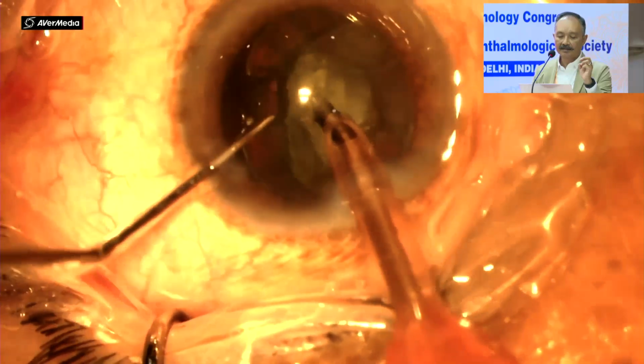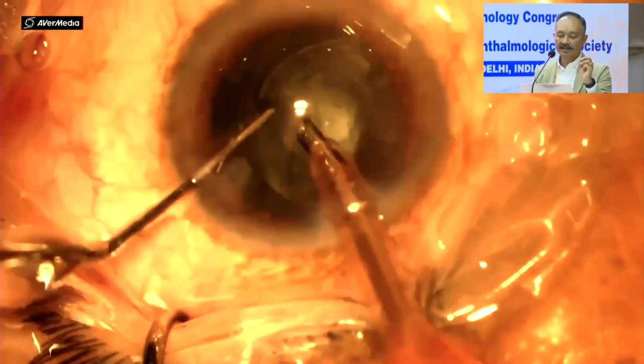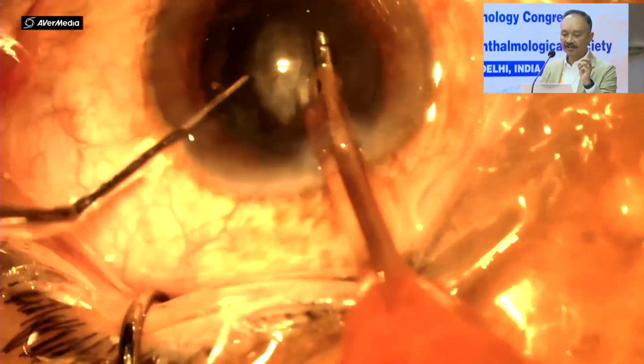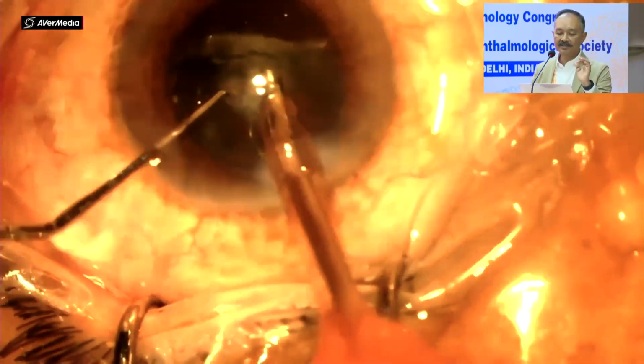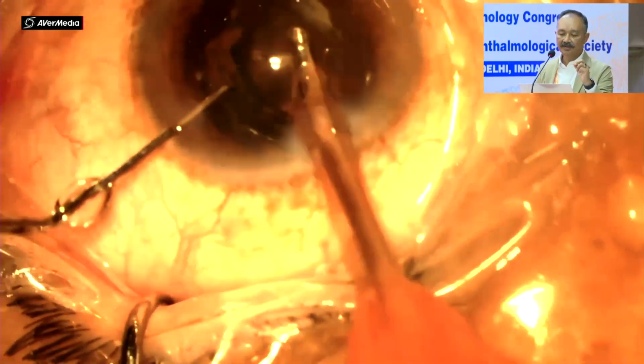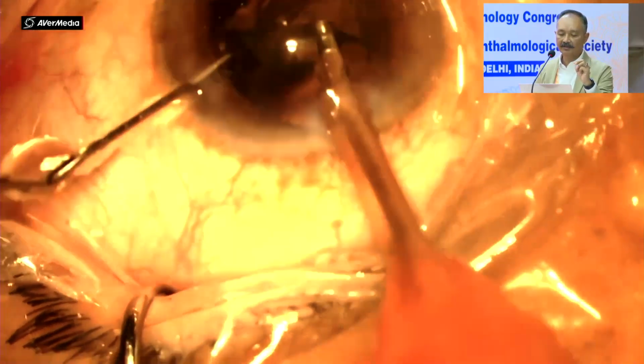and the central hard nuclear part has been removed. I'm just fast forwarding the case. Now the epinuclear plate remains, which can also be very easily handled by this reverse Kelman phaco tip.